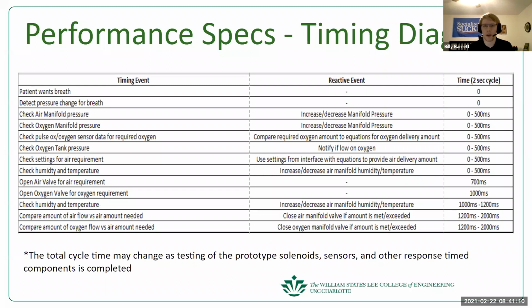Then opening the valves. I'll get to this in another slide soon, but we did some experimenting on the solenoid valves, and they're very fast. It's hard to tell how fast, but they open and close pretty quickly with power. It's probably more like 50 milliseconds or something. Yeah, sounded about right. It was an instant click and instant depressurization, so it was nice. This may change depending, but this is the timing diagram as we built it. Next slide.